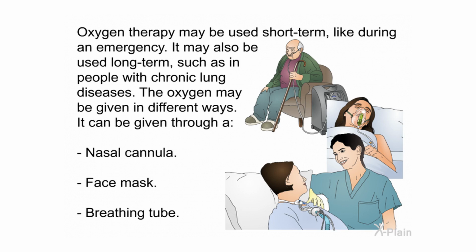Oxygen therapy may be used short-term, like during an emergency. It may also be used long-term, such as in people with chronic lung diseases. The oxygen may be given in different ways. It can be given through a nasal cannula, face mask, or breathing tube.